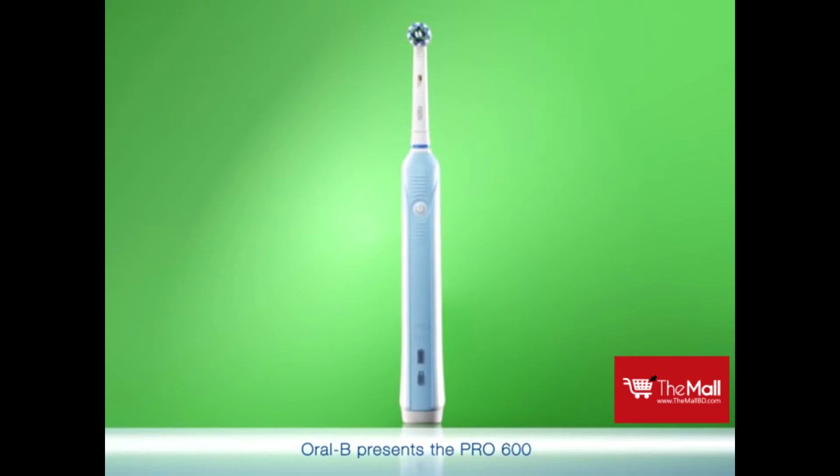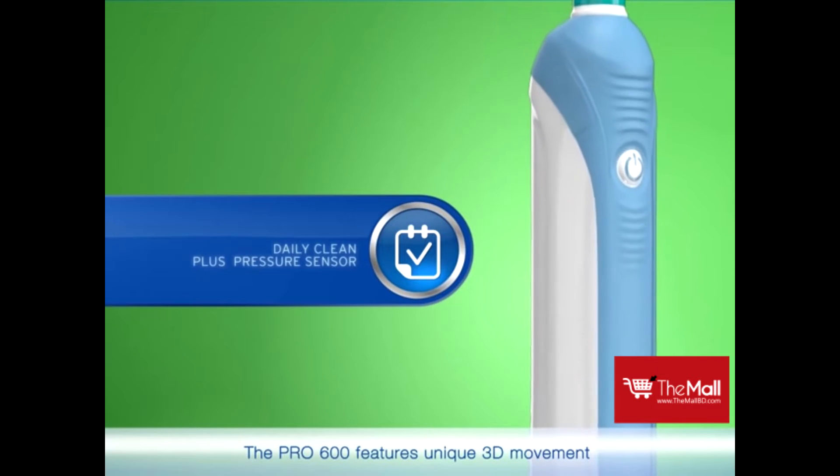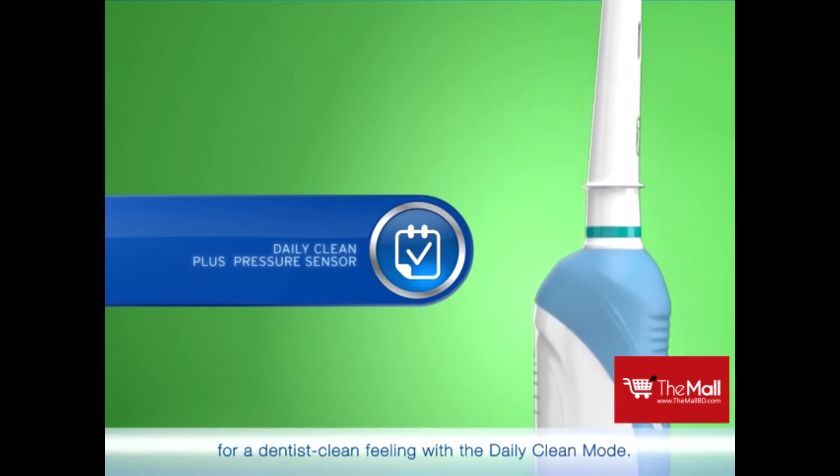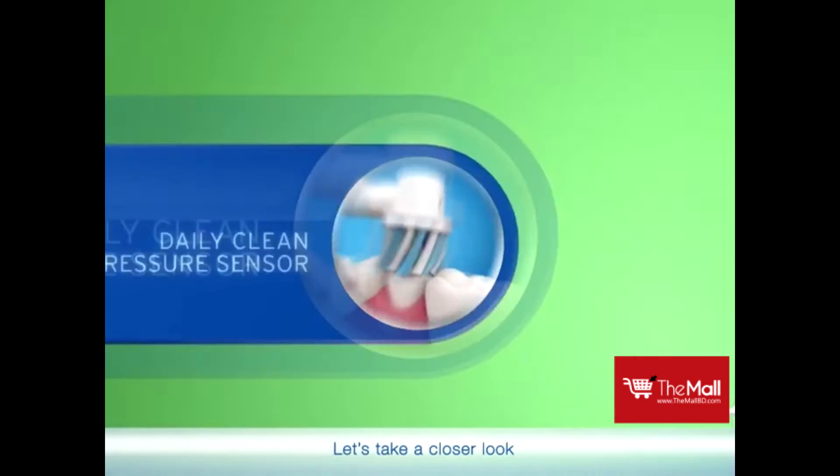Oral-B presents the Pro 600, which helps you get the clean you need. The Pro 600 features unique 3D movement for a dentist clean feeling with the daily clean mode. It also includes a pressure sensor. Let's take a closer look.